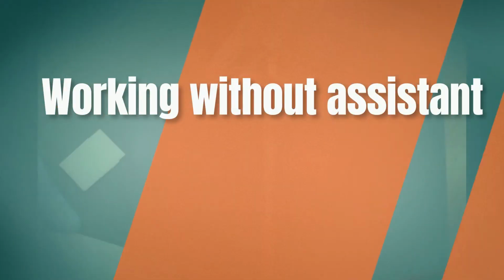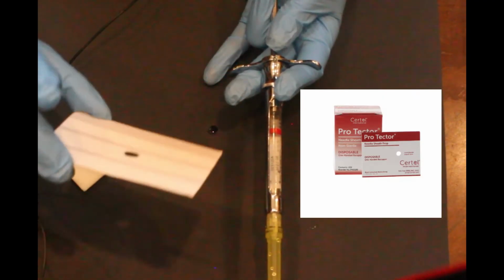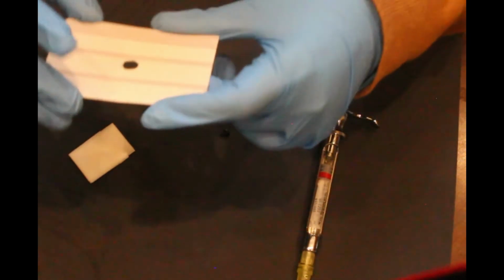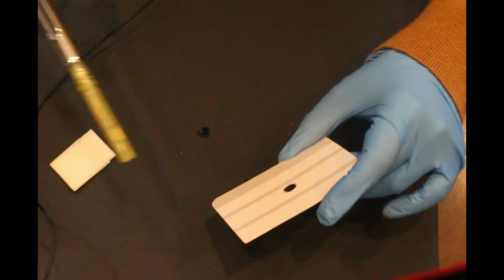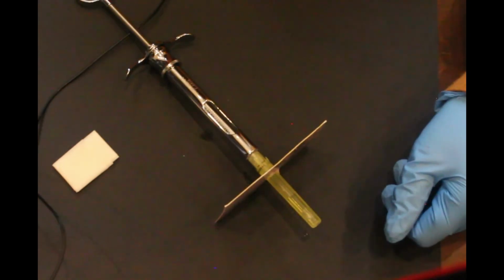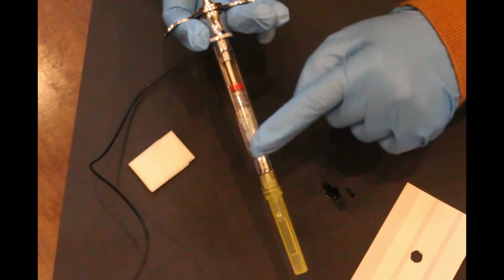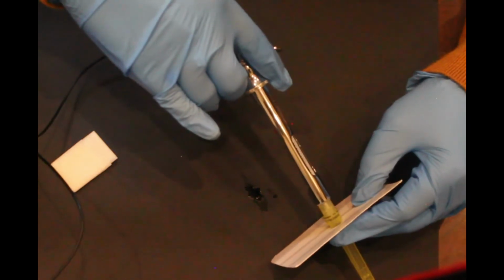When the operator is working alone without an assistant, to prevent needle stick injury, one can use a protector sheet. I did not have one handy today. I punched a hole in thick cardstock paper and I'm using it to show you how a protector sheet could be used. The assistant can leave the syringe loaded with short windows facing up. So when the operator pulls it out, they have the long window facing towards them and they can use the syringe like that. Now let's put it back in position and continue with our demonstration.